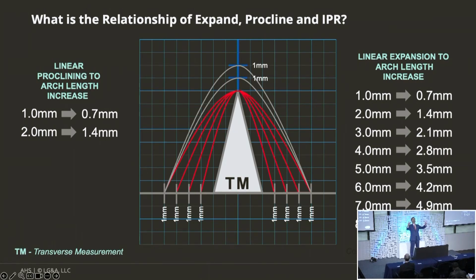Yeah, it's not 4 millimeters of expansion, it's 2 on each side. Do you know what's happening to your molars when they're leaning like this? Your lower molars that are inclined, do you know how far you have to move them to get them vertical? Do you know how many millimeters this shift is? That's a lot of millimeters to upright your molars. Can you do 2 on each side? If you could do 2 on each side, you just lost 2.8 millimeters, almost 3.